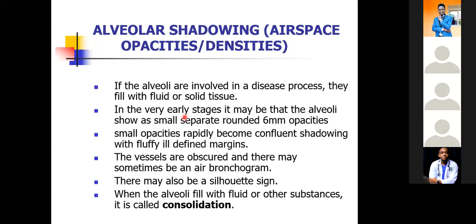As they become confluent, we begin to see a larger opacity which looks fluffy or feathery with ill-defined margins.